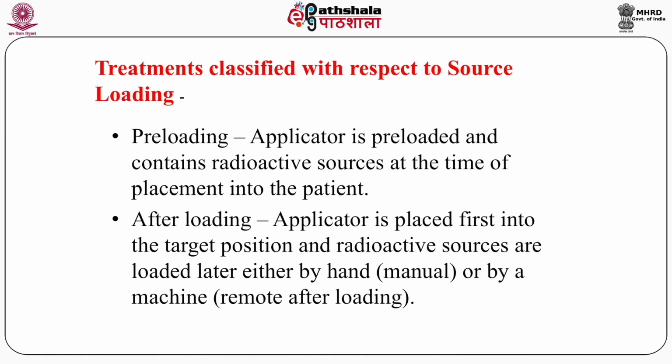Now further classification of brachytherapy is on the basis of source loading. In olden days it was preloading. The applicator is preloaded and contains radioactive sources at the time of placement into the patient. In this case, the person who is loading the radioactive sources will get very high doses, and nowadays it is not used in practice.